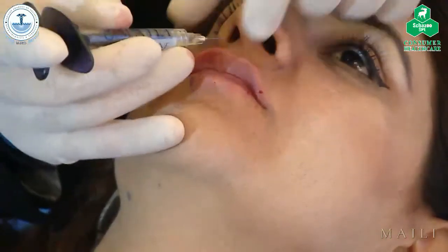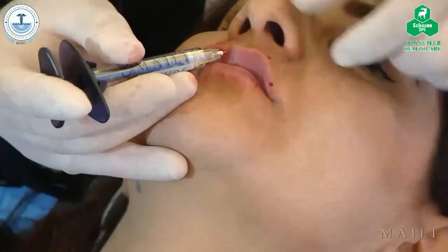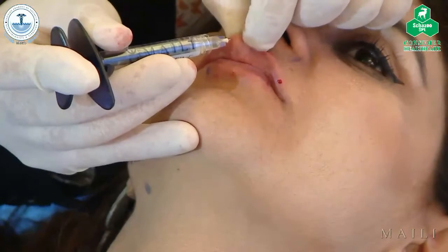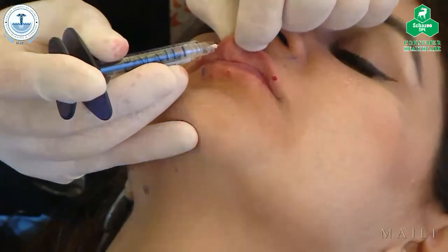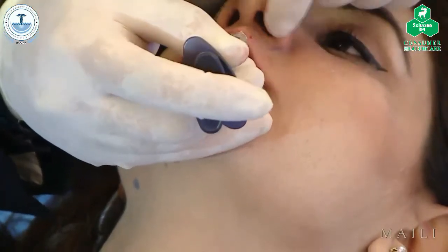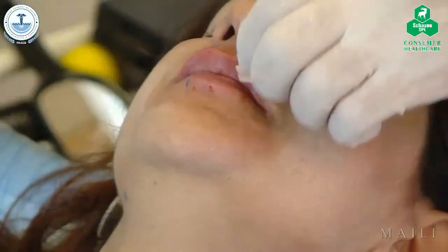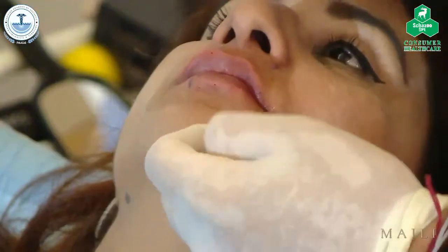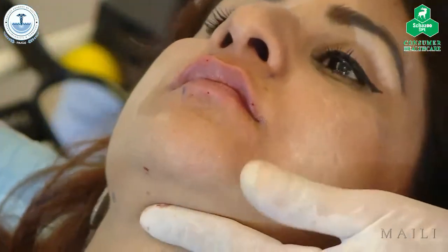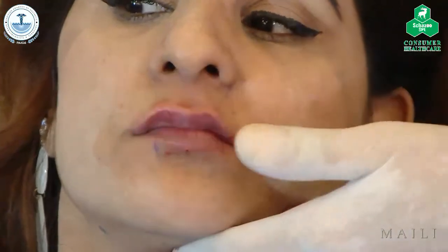I'm going to give now my philtrum. Did she have a philtrum before? A teeny weeny bit, I could see that here. Does anyone not have a philtrum? Sometimes, if a patient has no philtrum, no cupid's bow, and you are injecting it the first time, the immediate response after seeing in the mirror may be surprise. If you look to the past, this started in pictures and magazines and movies. Well, that's really nice.